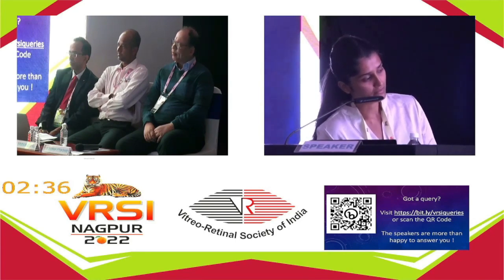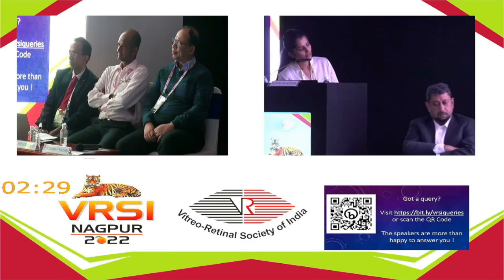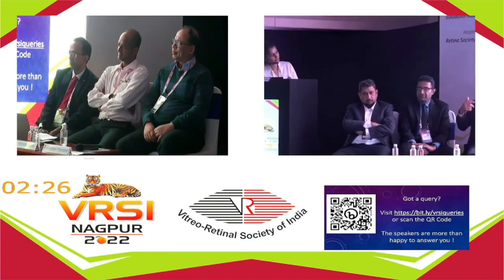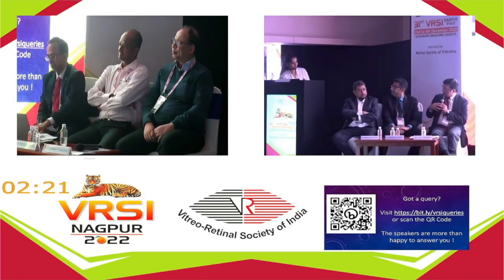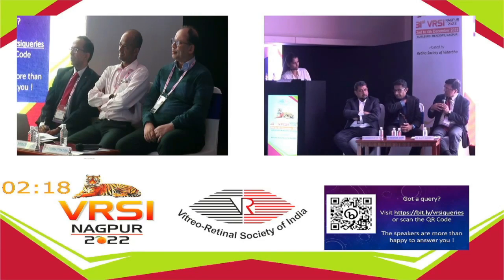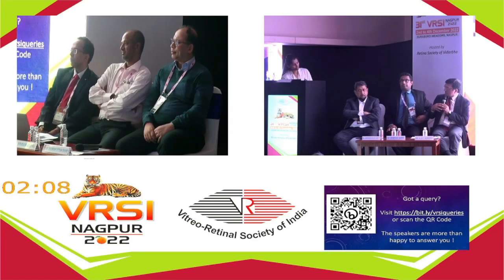And you said 187 out of 247. So there were 24% patients you were not able to do. Was it because there was some problem in alignment? It's basically because the technician was not able to achieve good images. So the inclusion criteria was not met, where the image was completely blurred, or the pupil was not dilated, or it was APROP which was not letting the pupil dilate. Those are the images which were tried, but not successfully done.